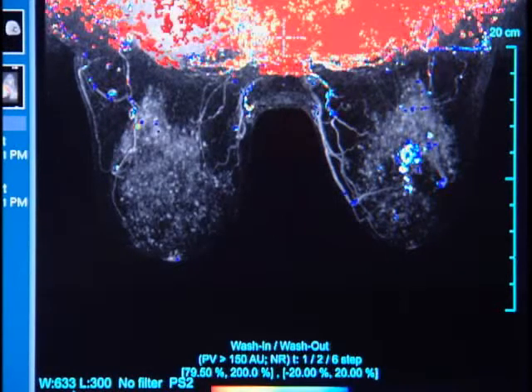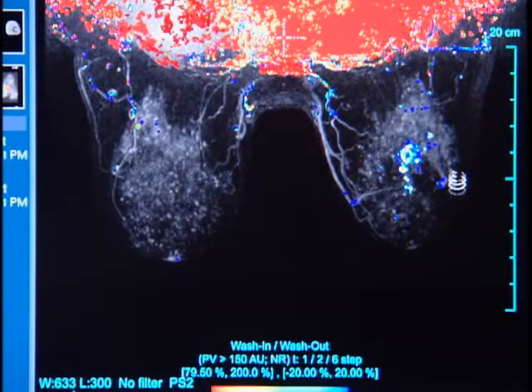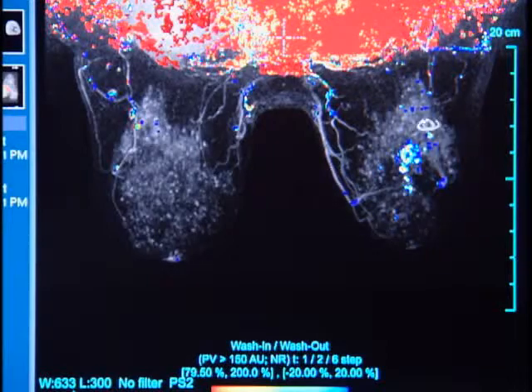Utilizing this hanging protocol, color parametric mapping can be applied, and you can see that this does in fact meet threshold degrees of enhancement.